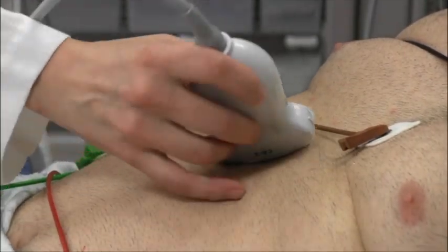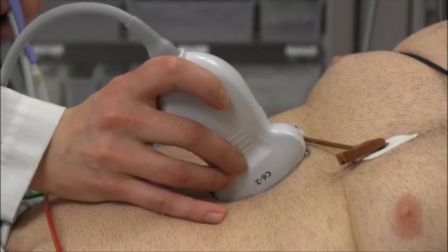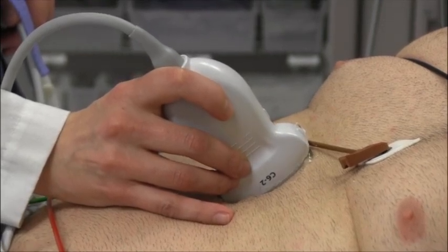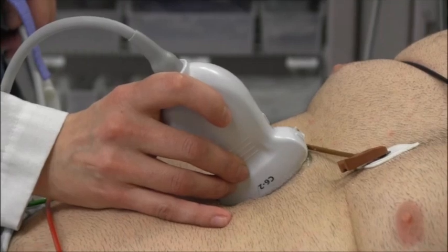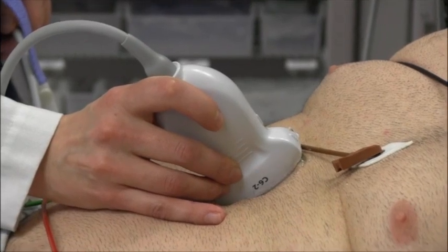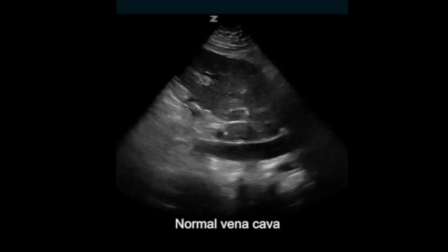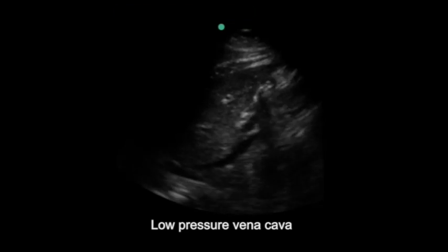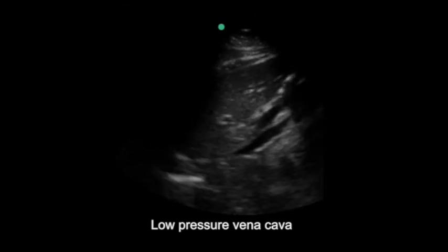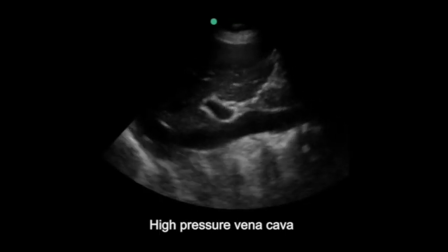Now we move to the inferior vena cava in order to evaluate the patient's tank. The vena cava can be imaged to estimate volume status. A low-frequency probe should be used to obtain a longitudinal image of the vena cava. Respiratory variation should be measured 3 centimeters proximal to the atriocaval junction. A normal vena cava will have a collapse of 30 to 70% with respirations. A low-pressure vena cava will be small and collapse more than 70% with respirations. A high-pressure vena cava will have minimal collapse during respirations.